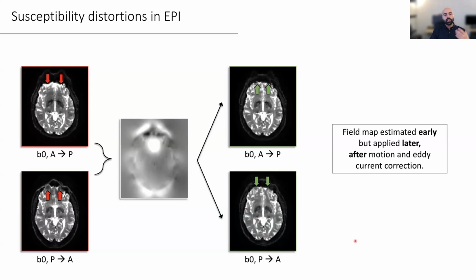So this is also done so we can avoid multiple steps of interpolating the data, because each one of these steps is one that requires data interpolation. So we're stretching or compressing images, which means we need to re-estimate the exact value per voxel. And doing many of these re-estimation steps will cost something at some point. So the fewer we do, the better. And this is one way we can do that.